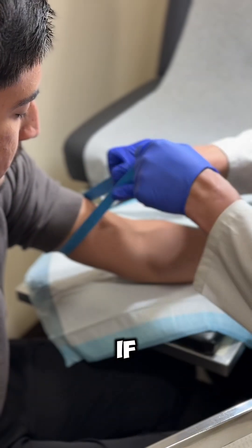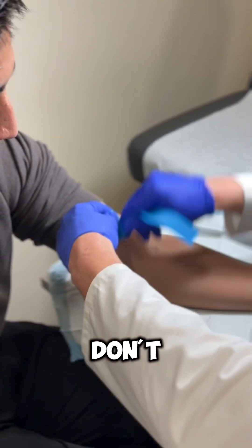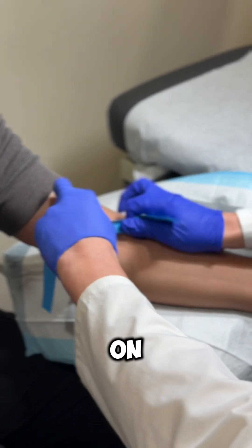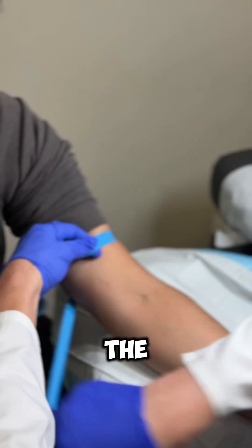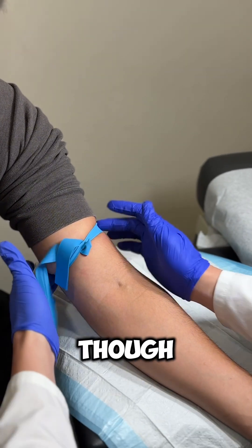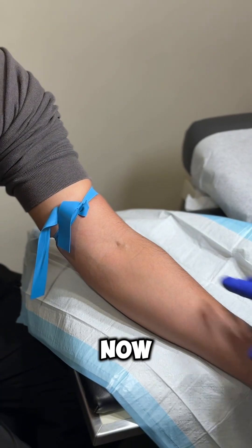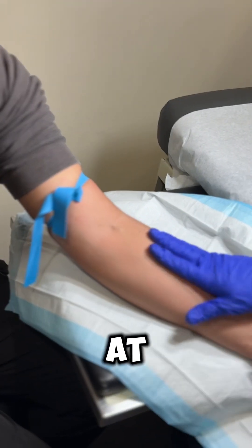What I try to do is either put the tourniquet on top of the clothing, or if you want it really smooth, don't lay it flat because it's going to be in the way — kind of do it on the side. So I get it on the side and tighten it. Even though it's tight, it's not going to be as painful as if it rolled over.